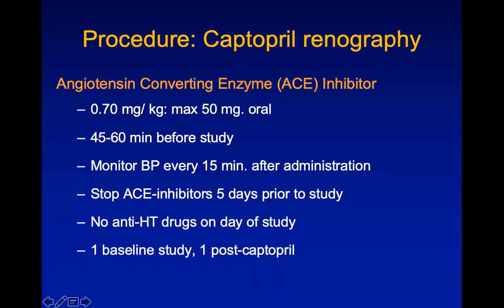You have to monitor the BP carefully every 15 minutes after administration. You have to ensure that ACE inhibitors are stopped at least 5 days prior to the study, and no antihypertensive drugs are given on the day of the study. You need one baseline study and one post-captopril study.